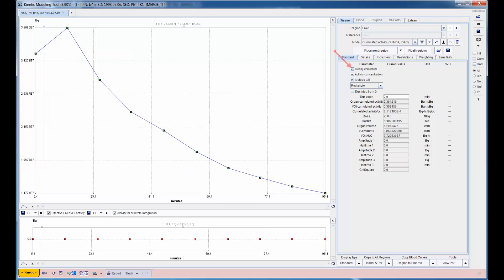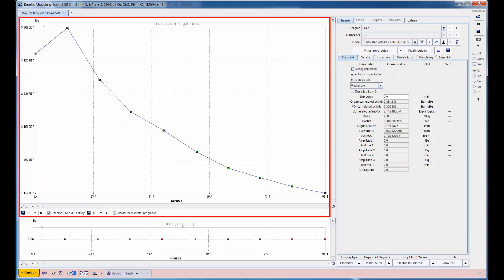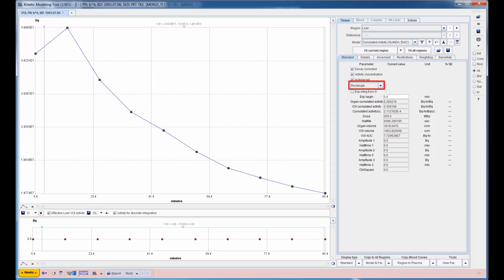The model undoes decay correction, multiplies by VOI volume, and shows the resulting activity in the organ over time. This curve is then integrated using appropriate options for interpolation between the measurements and extrapolation to infinity.